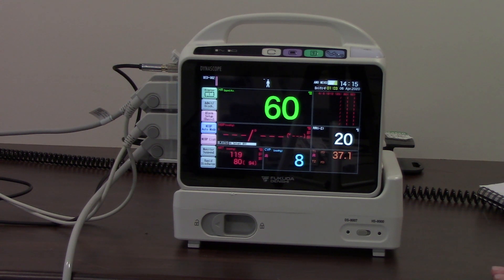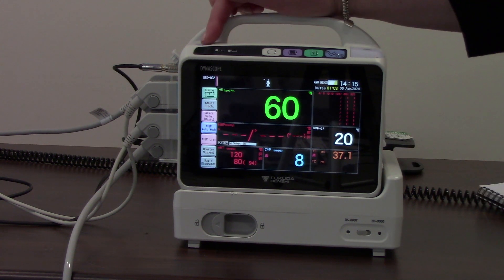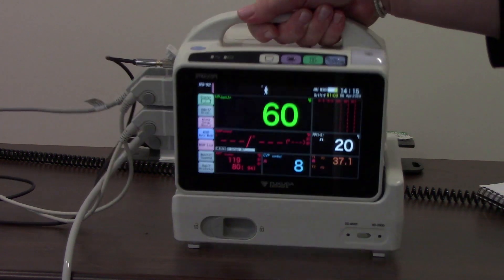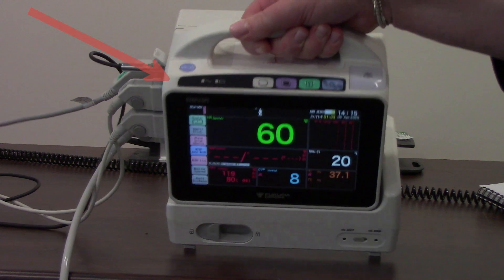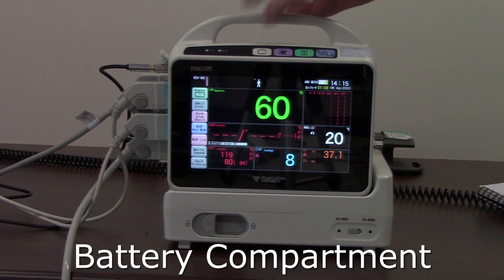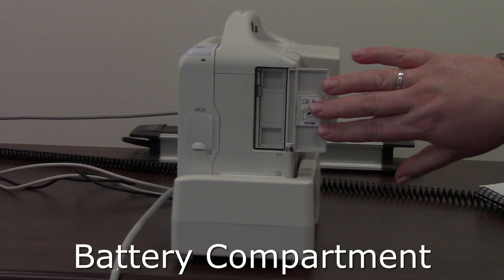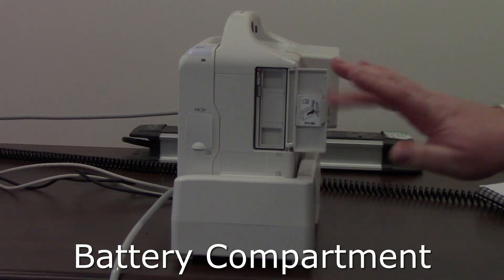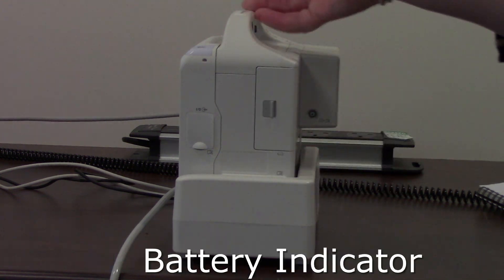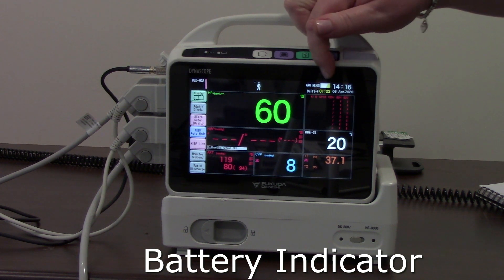Those are the main features and functions of the 8007 monitor. A couple of other things to note: your on/off button is just here at the top. If I turn it to the side, this is where your battery lives, and your battery indicator is just here at the top.